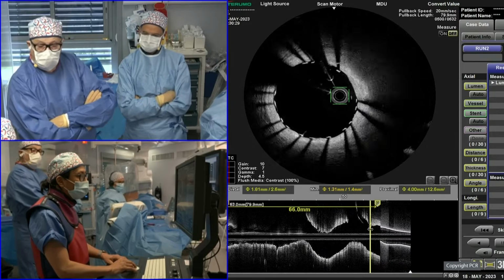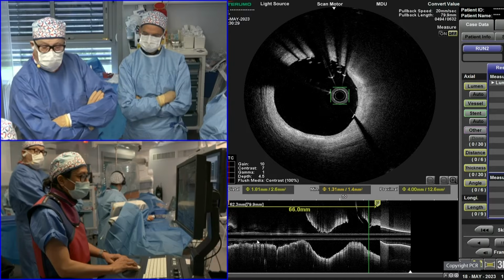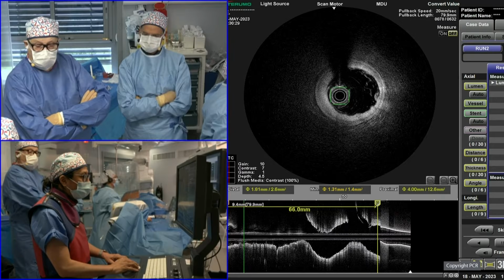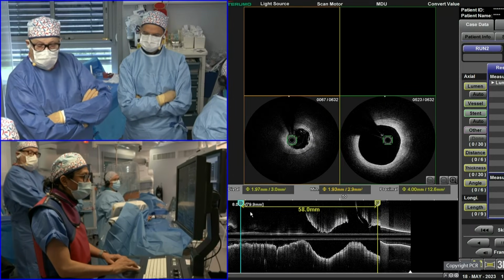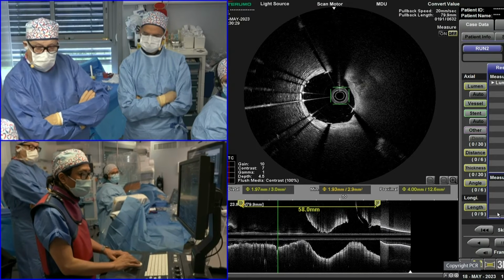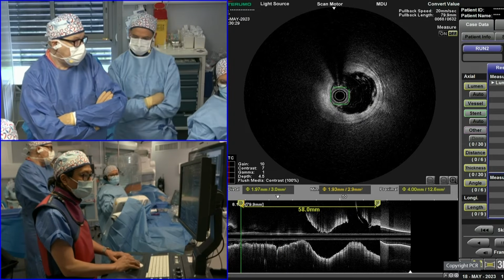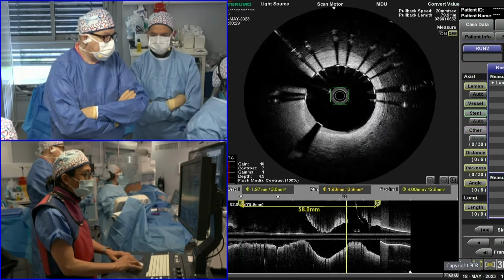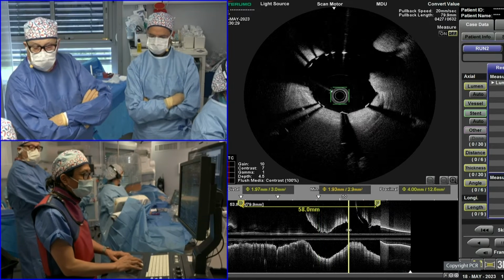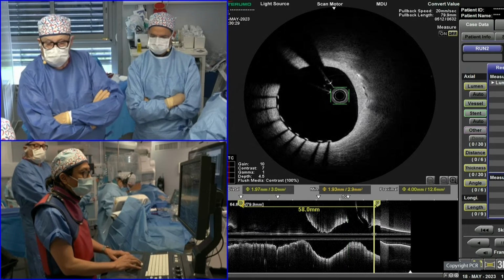So obviously that distal cell cross was with the hope that you place the struts that may well have been jailing the side branch across onto the lateral wall, clear of the circumflex ostium. And I think it's important to go back to considering the stent technology in terms of this two-linker type approach. We will show a few more slides, but we want to finish the procedure first, and then I will ask Dr. Kinoshita to show direct bench comparisons, just to lead us through the difference in Tansei versus Nagomi.